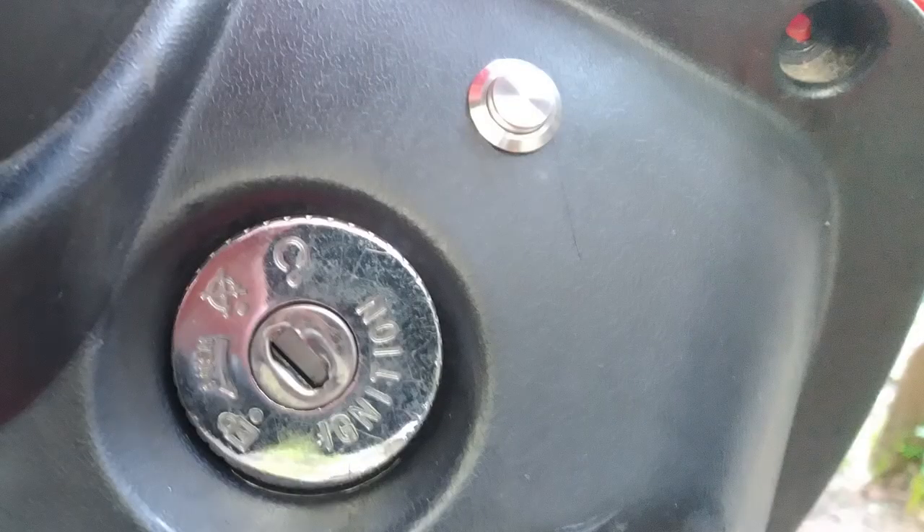The key that was used for this thing was a screwdriver, so I've replaced that. I am replacing that with a push button.